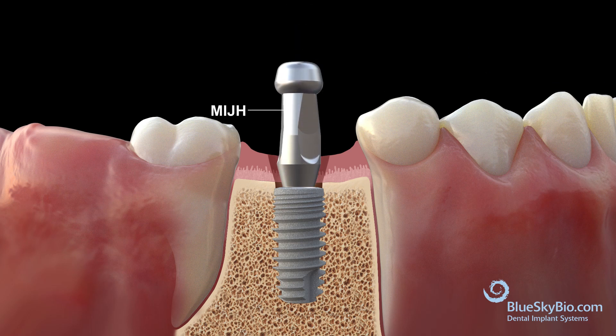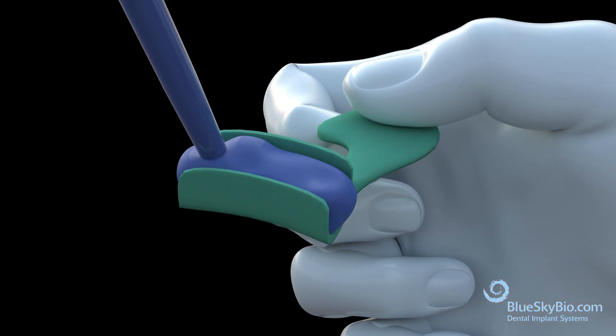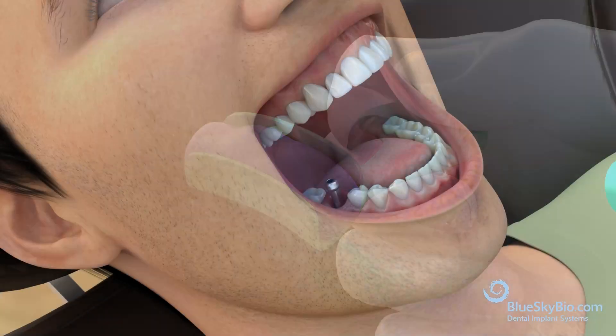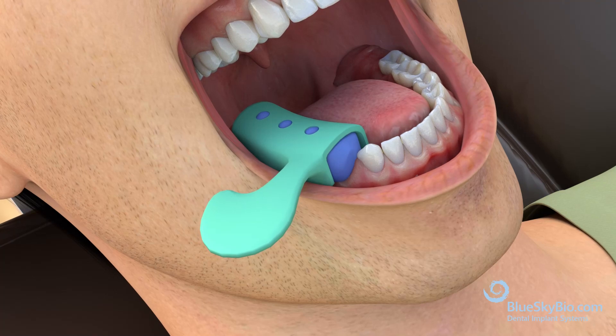Place the Biomax impression coping and hand tighten only. Fill a posterior tray with impression material and place over the impression coping. Once the impression is taken, remove the tray.